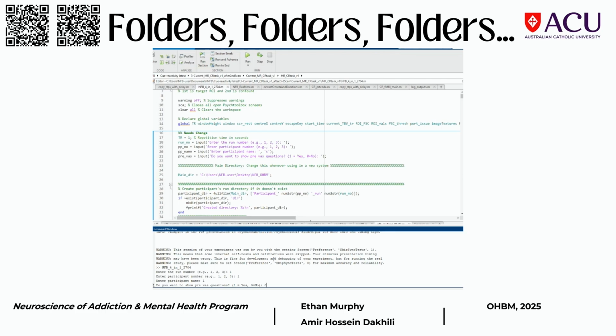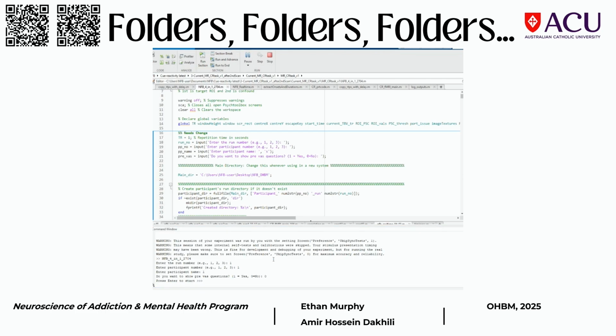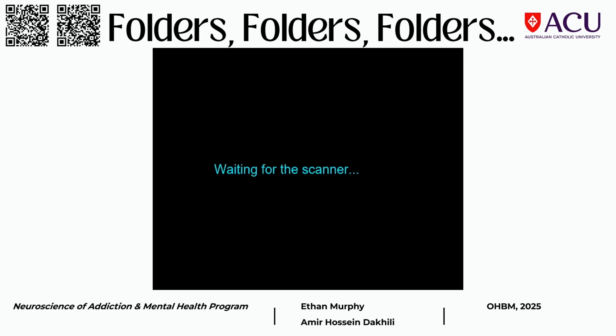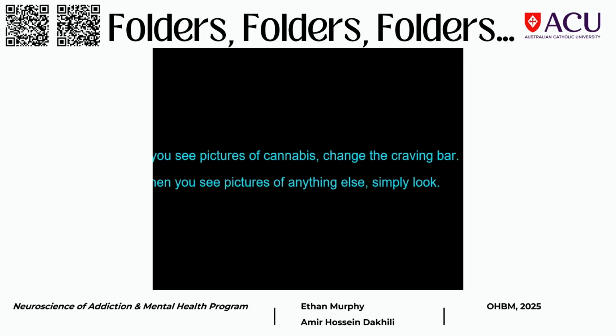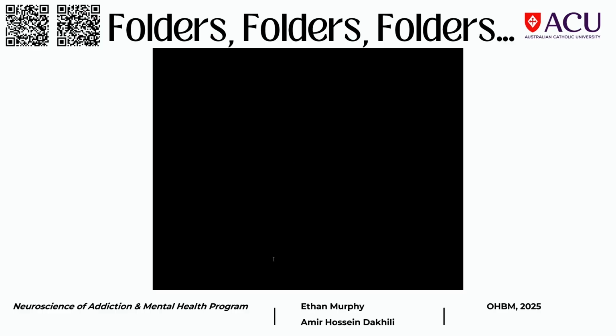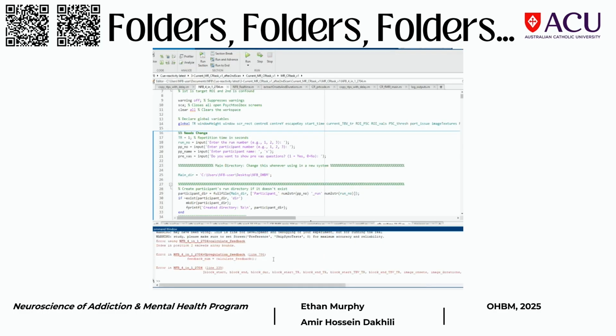We started TurboBrainVoyager, and at the same time we are starting the MATLAB task. They ideally should start at the same time, and MATLAB looks for receiving data from TBV to show the bar to the participant. But we've faced this hard moment so many times, to be honest. This is so hard and painful even now. Boom, crashed. What do you think was the issue?